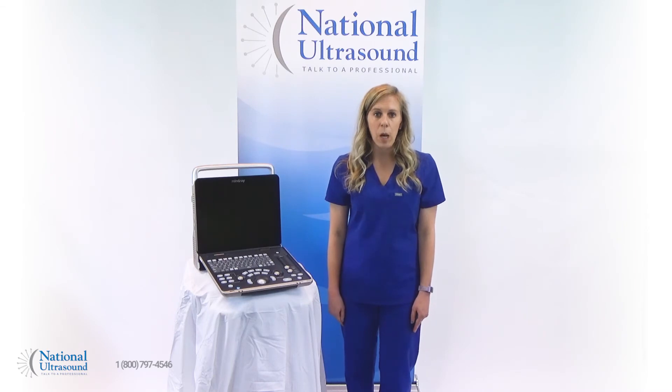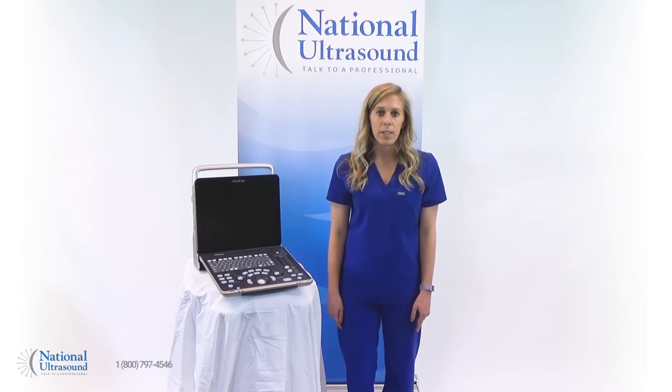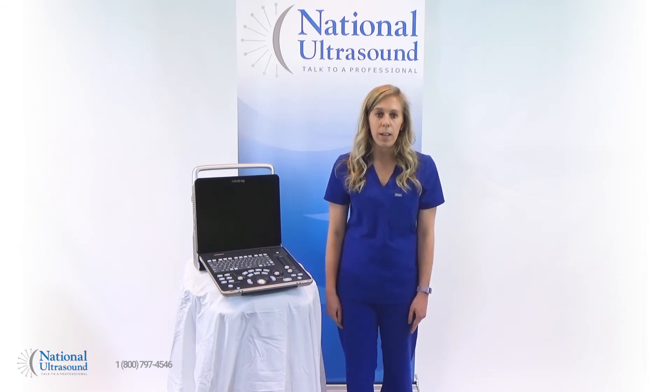With its convenient laptop configuration, 15-inch screen, and intelligent workflow, the Z60 makes it easy to perform fast and accurate exams.